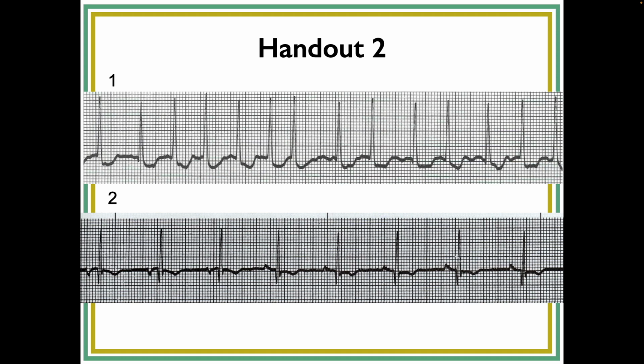I don't know what's going on right here, because either that's not a P wave or it's inverted. It's an inverted P. So you have 1, 2, 3 inverted P waves, so that's already not sinus. And then you have your P waves maybe right here. So the P wave morphology changes. Correct. Let's just finish everything up before you put it all together.